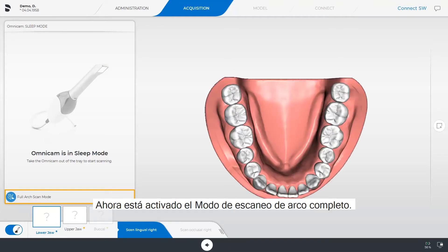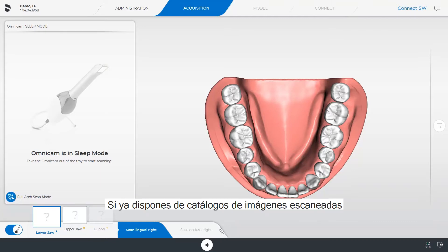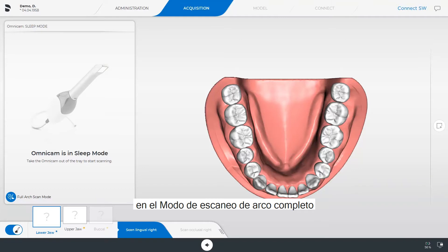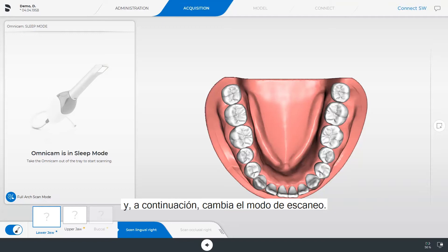Applying the full arch scan mode is optional. The activation takes place via a button in the camera view window. The full arch scan mode is now enabled. If you have already scanned image catalogs in full arch scan mode and want to switch back to standard scan mode, you can simply delete the data from the existing image catalogs and then change the scan mode.